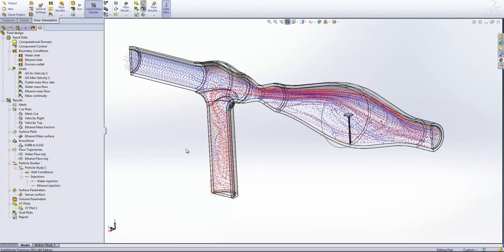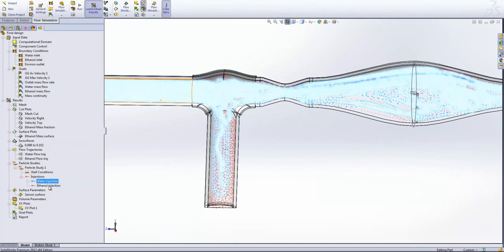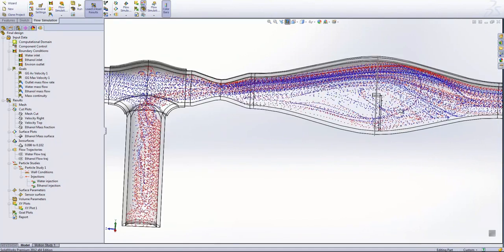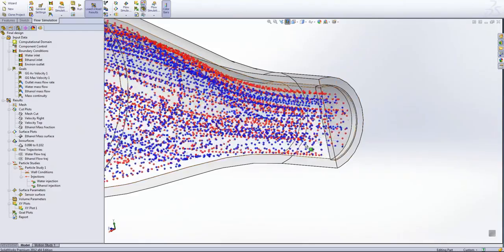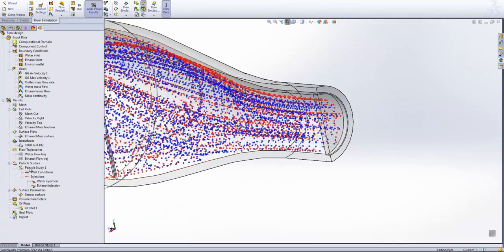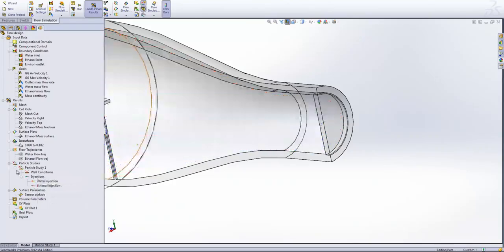I've got two particle studies here, so I've injected ethanol and water at each of the separate inlets, and you'll see how nicely we can animate these and see how we've got this mixing action inside here, and how by the end at the outlet we've got a pretty good mixture of both blue and red particles, signifying a nice mixing action within that tube. So let's hide those.